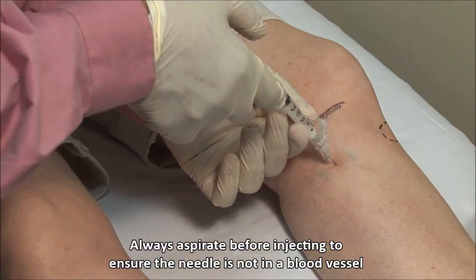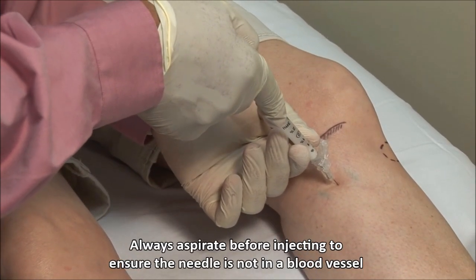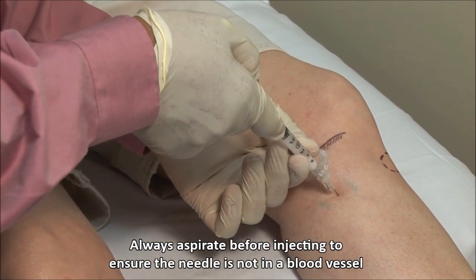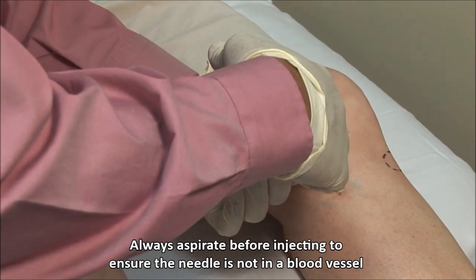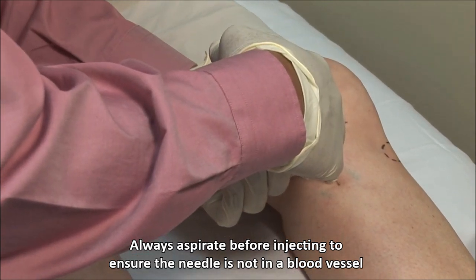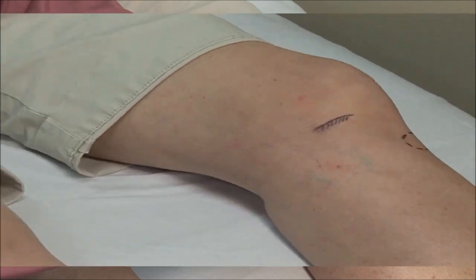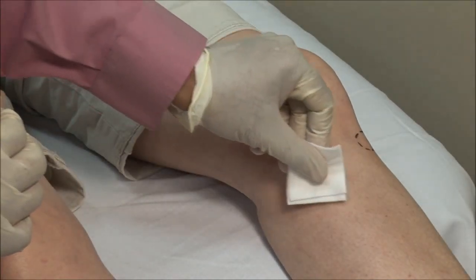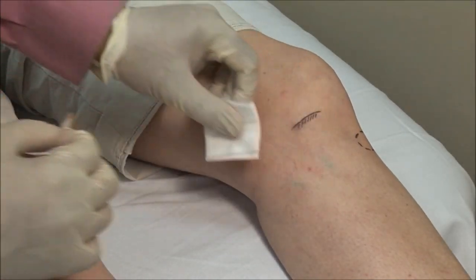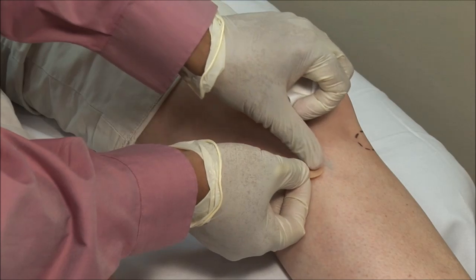Always aspirate to ensure that you are not in a blood vessel, and then inject the solution. Finish off by drying the site and applying a bandage.